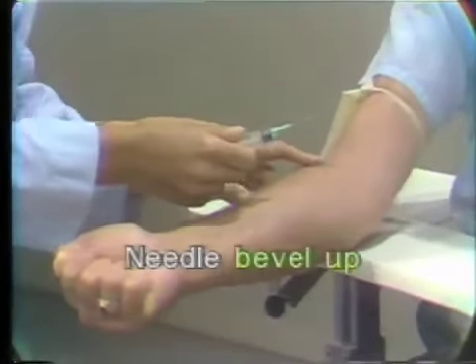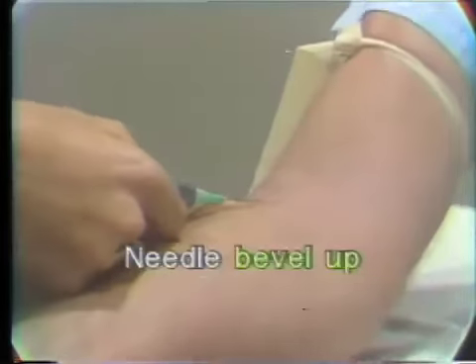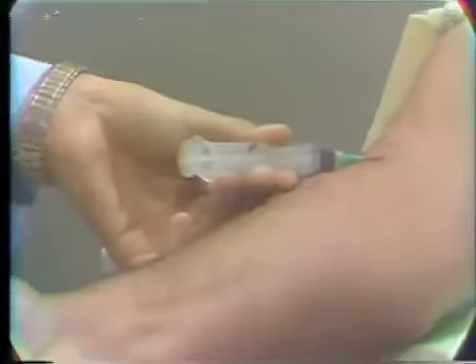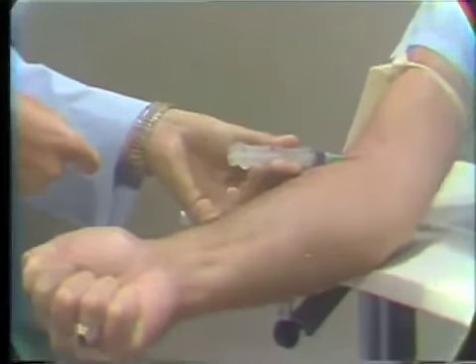The bevel must be bevel up. You pull the skin tight, have the bevel up, go directly into the vessel. Now I'm moving my hand, and I still have a rest position on this side. So you will notice, you'll see some of the blood came out, and some of the blood is in the hub.